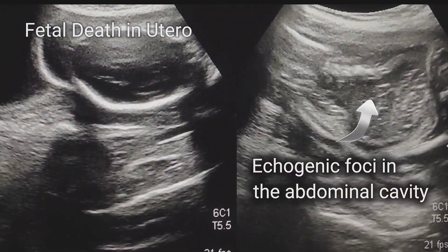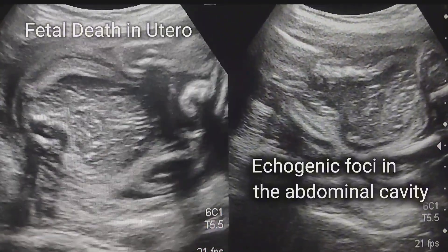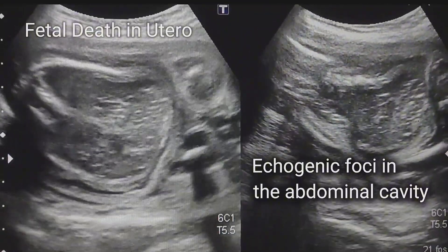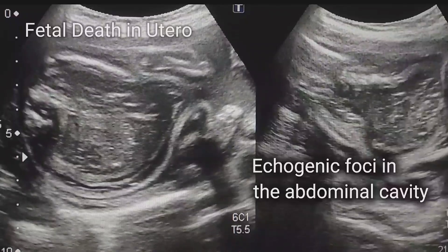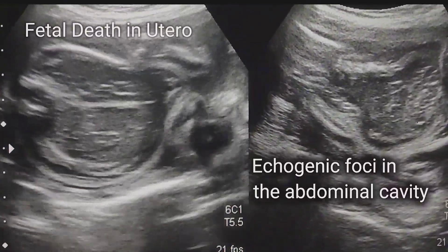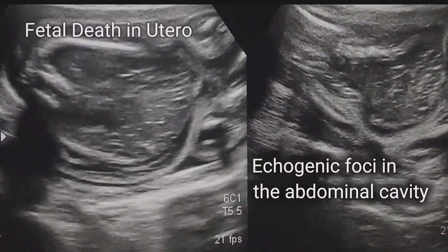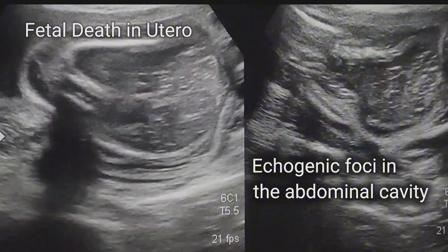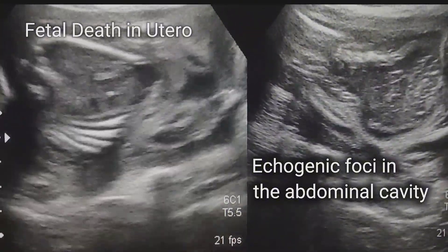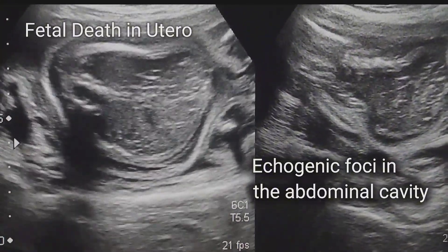This is very typical of fetal death in utero. Other reasons which may cause fetal echogenic foci are associated with aneuploidy, TORCH infections, and intrauterine growth restriction (IUGR).